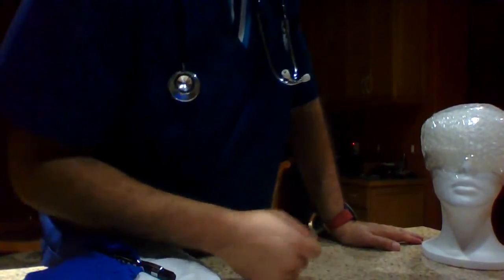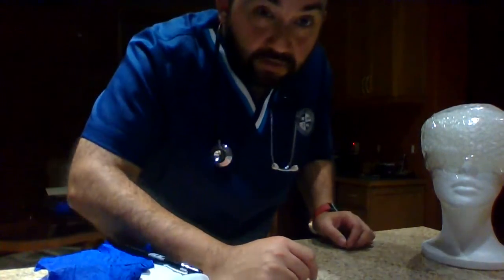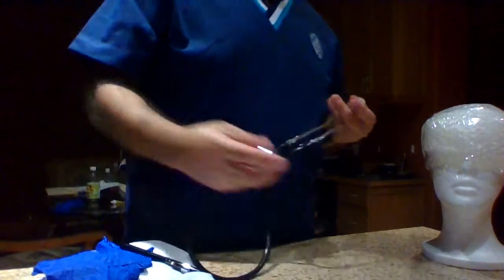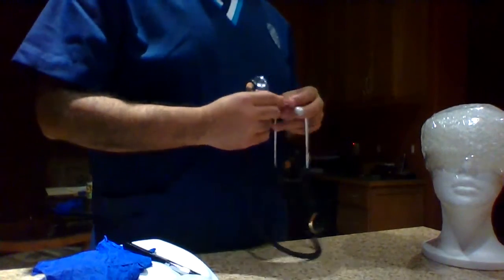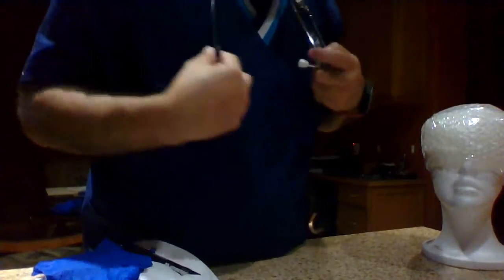Okay, so now we're going to do a GI assessment for the need of a nasogastric placement. So you're going to be listening for the bowel sounds. I don't have a stomach to do that, but you always place these out, you assess. So now you've got the information that you need.